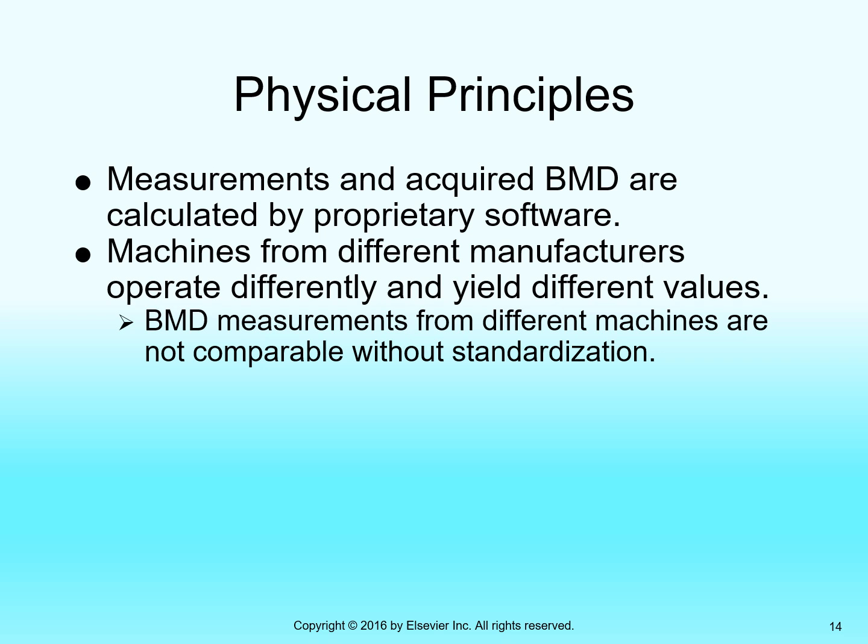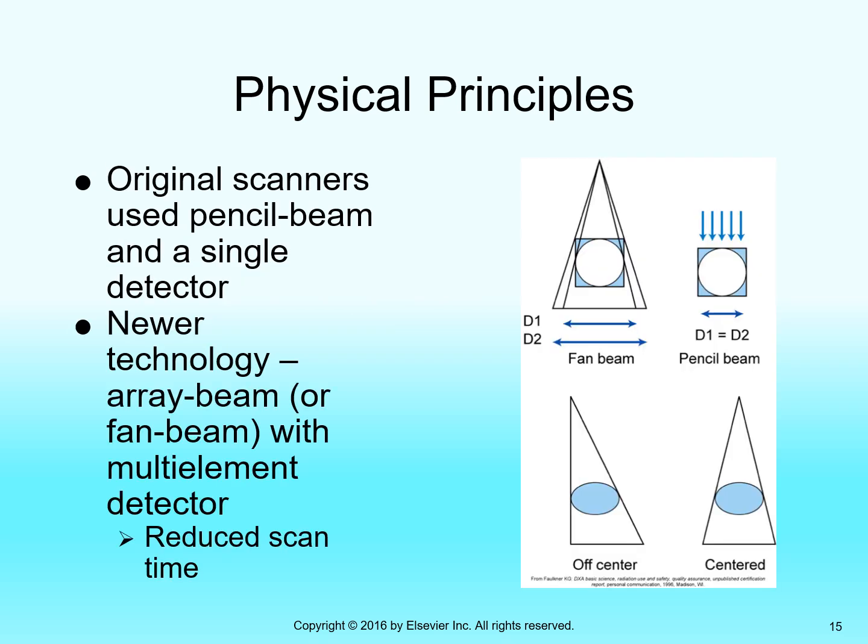If you find yourself in the future as a bone densitometry patient, just understand that you're better off, as far as long-term tracking of progression, going to the same provider over and over, like every 6 months, every year, every 2 years, whatever it is that your physician recommends as the follow-up frequency. Just remember that you should go back and get the exam done on the exact same machine that you were first diagnosed on, so that the data is more useful because they don't have to compare across different machine types. Okay?